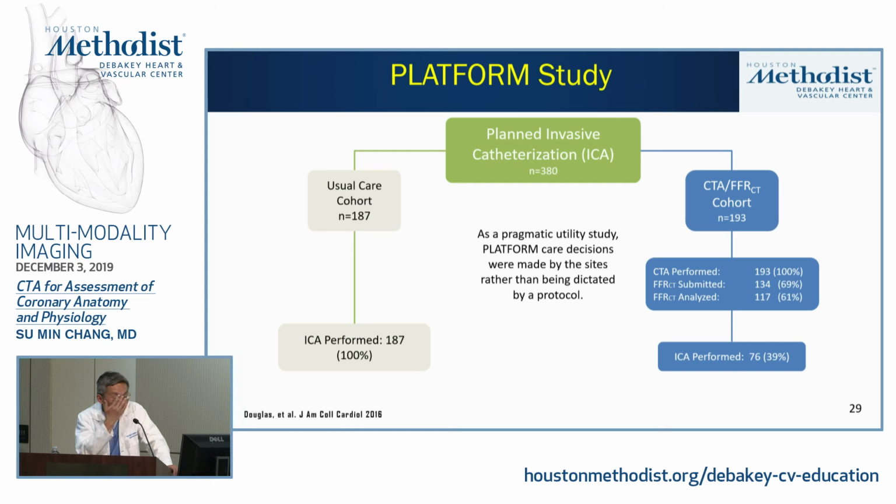Obviously 100% of the patients randomized to usual care got a cath. And what happened is if you do a CT-FFR in those patients, only 40% of the patients end up going to the cath. So essentially you eliminate 60% of caths, supposedly.